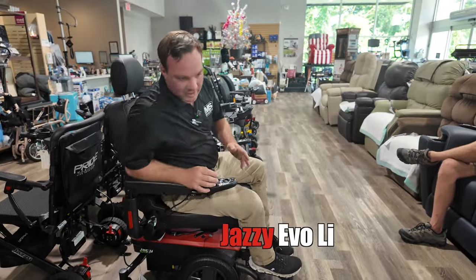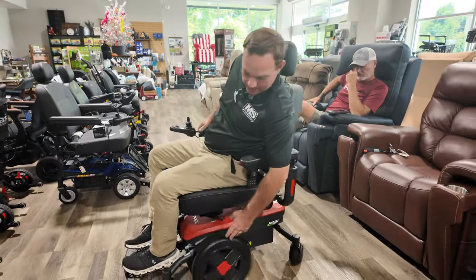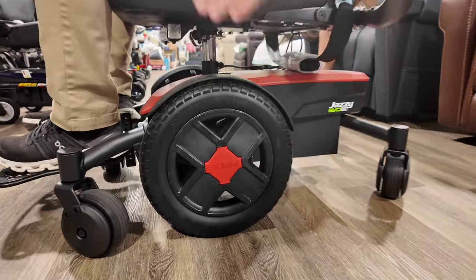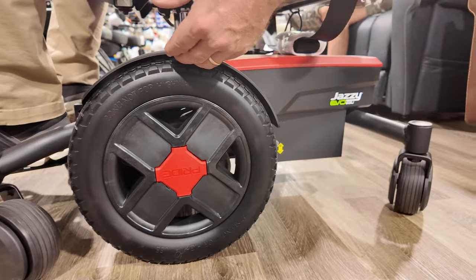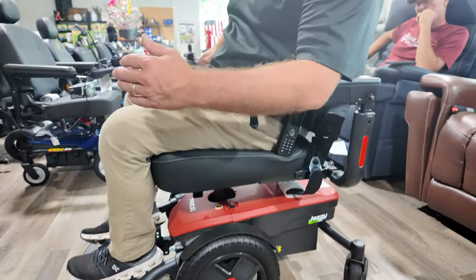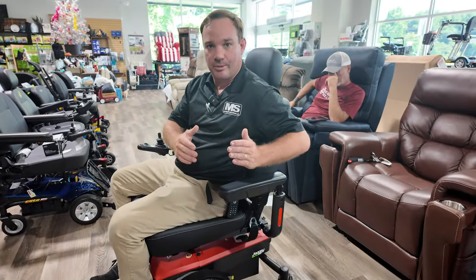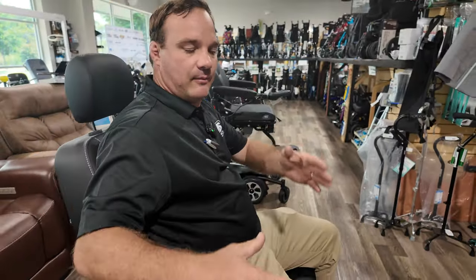The Jazzy Evo — they also make this in an HD version. It looks like a mid-wheel drive chair. They did a good job making the width narrow with pretty big tires. You can get outside with this unit. You can buy it with AGM or LI batteries — there's a difference. The LI costs a little more but the benefit is it's a solid brick battery inside.